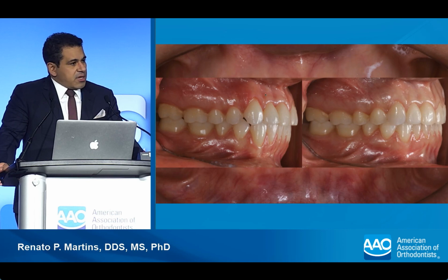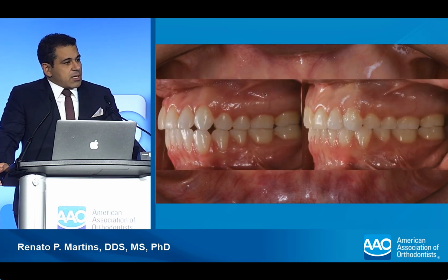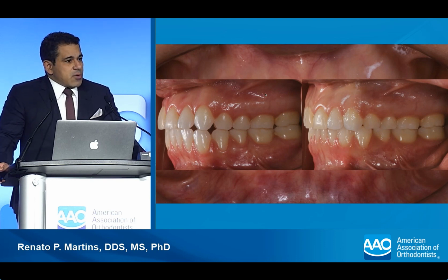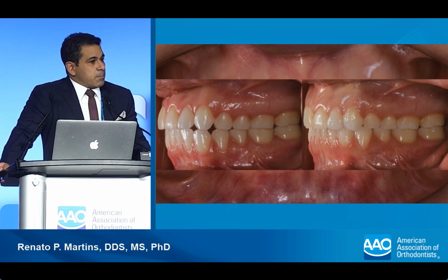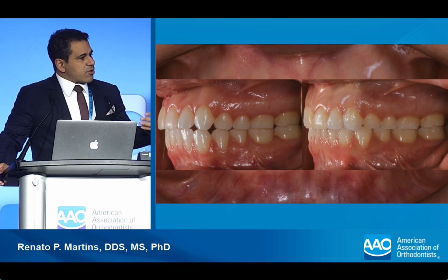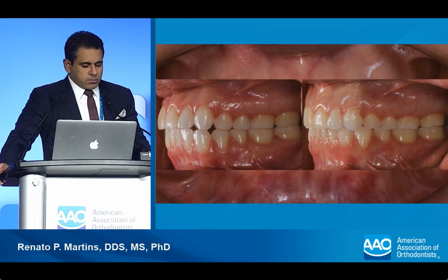But on the other side, if you look on the end-on class 2, and you focus your view on the incisors, you can see that we got approximately 2 millimeters of deepening of the bite, but there is no true extrusion here. It's only relative. So you can incorporate relative extrusion whenever you want to close a bite. You just need to do posterior IPR.